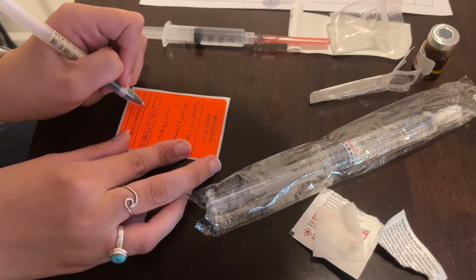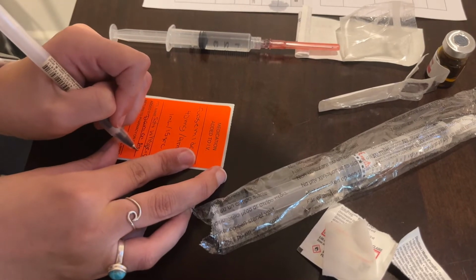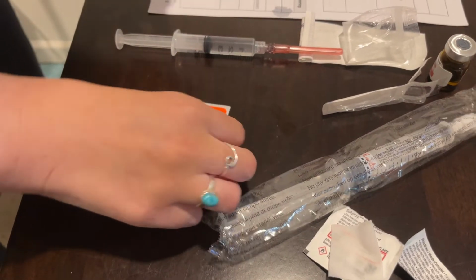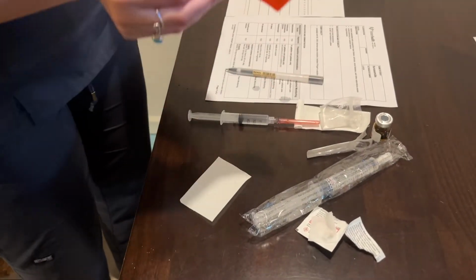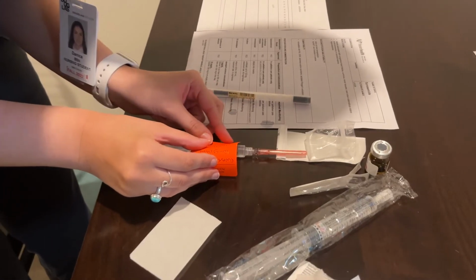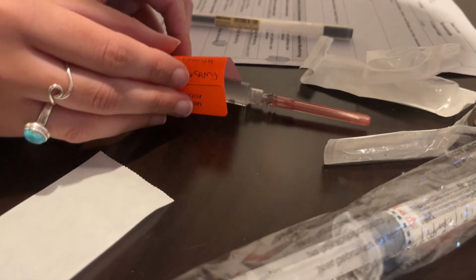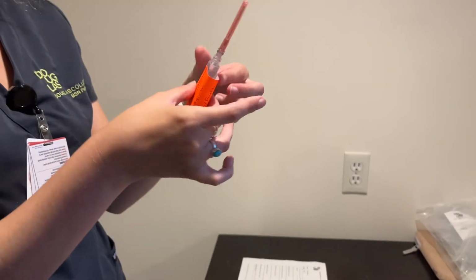And this is my name, just to make sure I added it. Now I'm going to be putting on this, but not where the numbers are, so I can actually see what I'm giving.